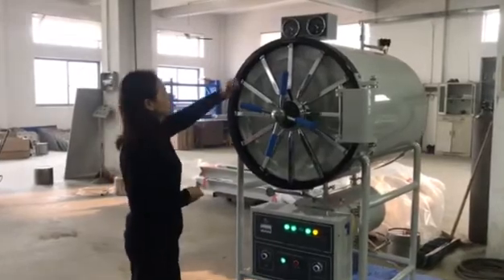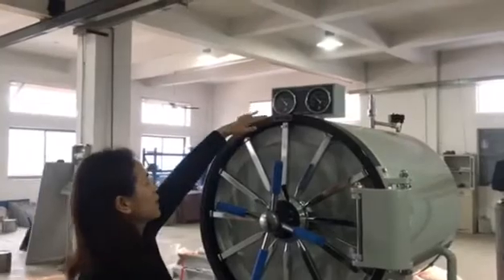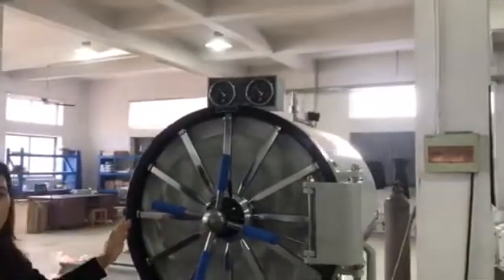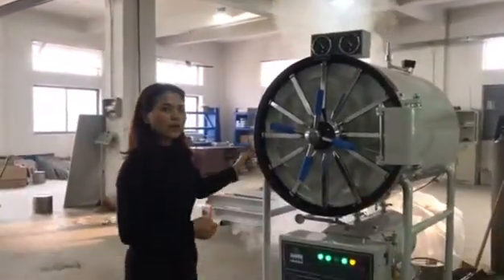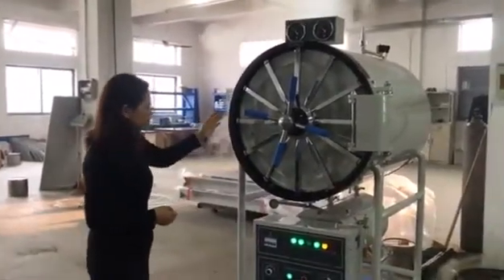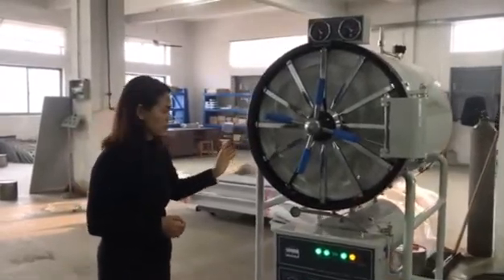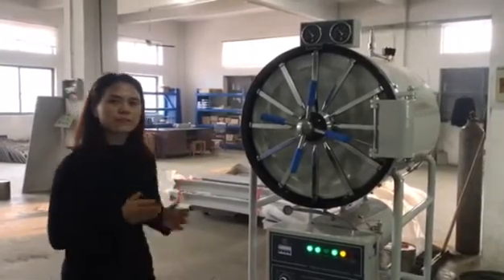Then we wait until the pressure goes back to zero. After the pressure goes back to zero, we open the door. Then later this machine will start the drying function process. Then the whole process will finish.